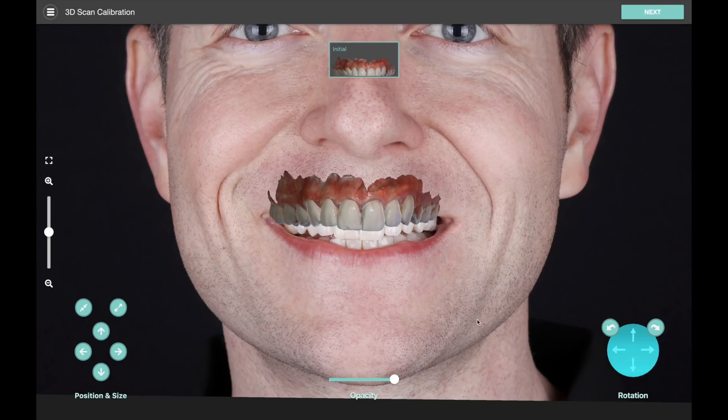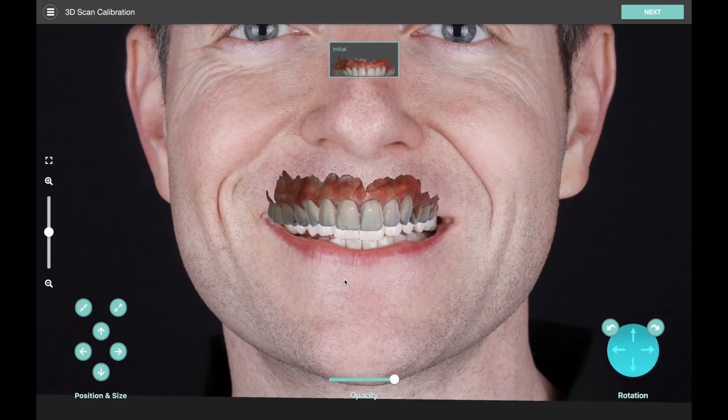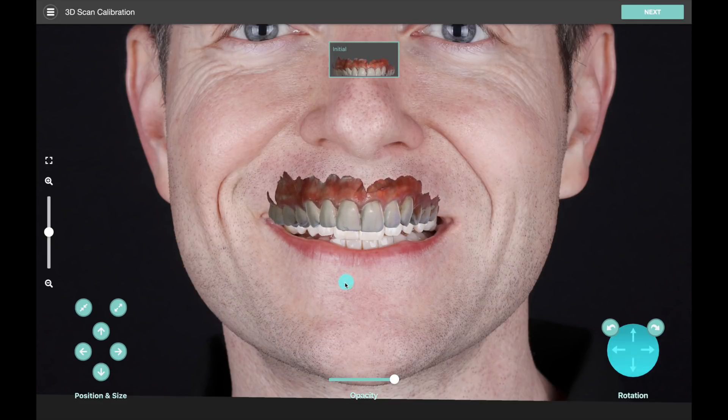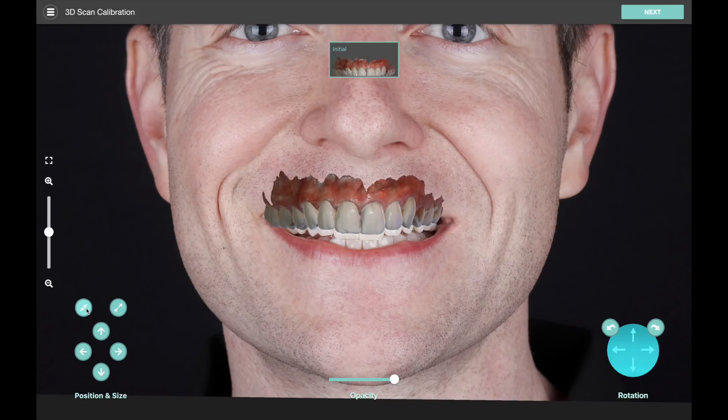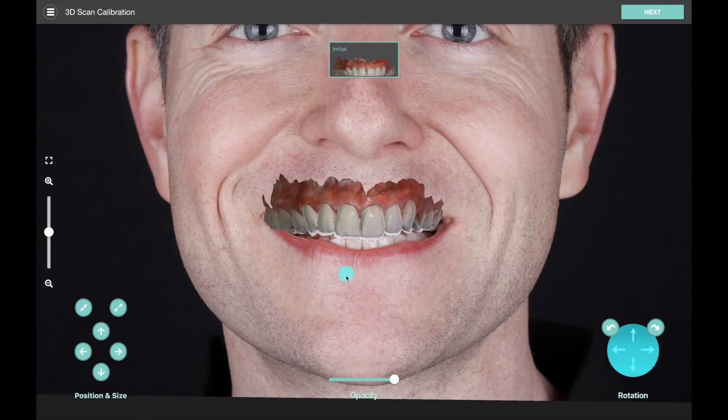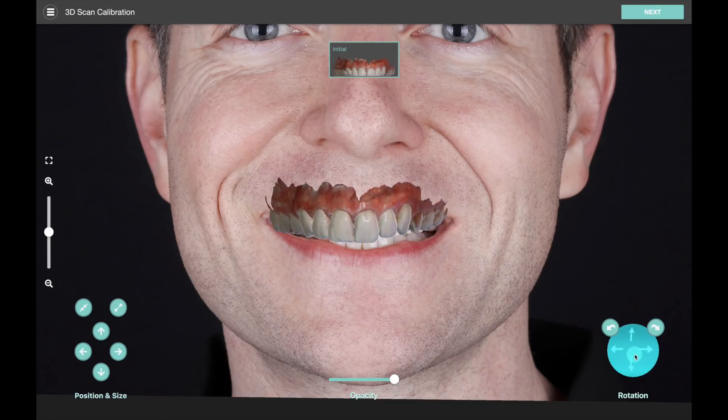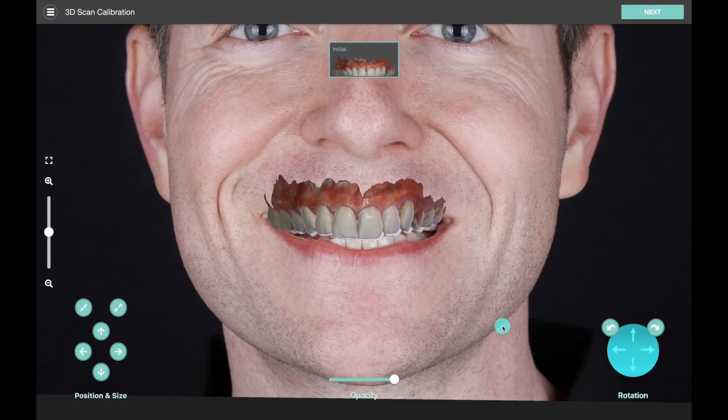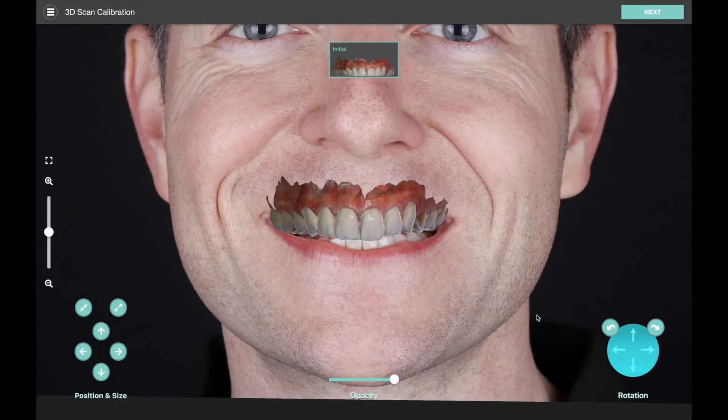On screen here we have a few different controls. On the bottom left we have positioning controls, and as you saw, I can also click and drag to move the model around quickly. Above the position controls there are size adjustments so we can scale the teeth to match the size in the photo. On the bottom right side are the rotation controls, so this helps us to orient the model correctly and get it to match up and then tilt it if we need to.